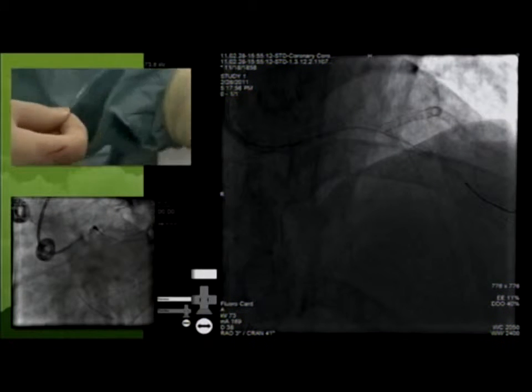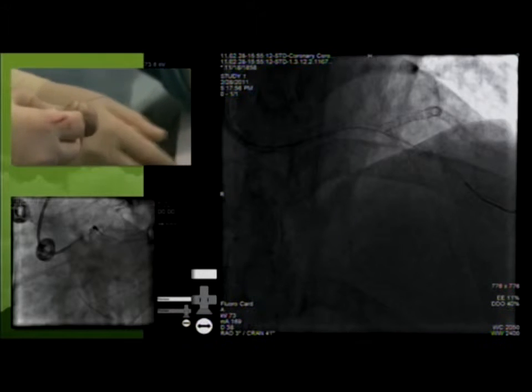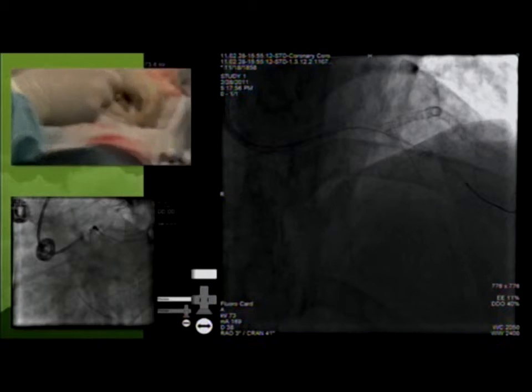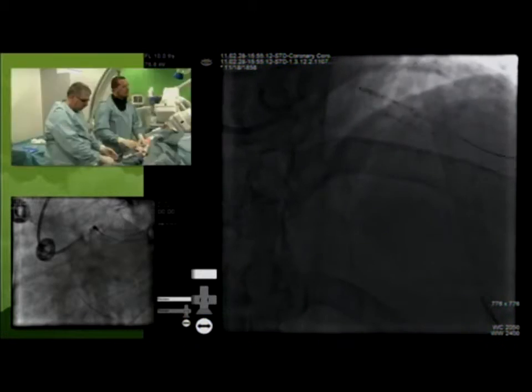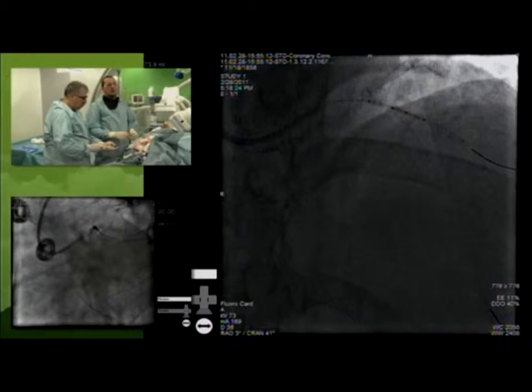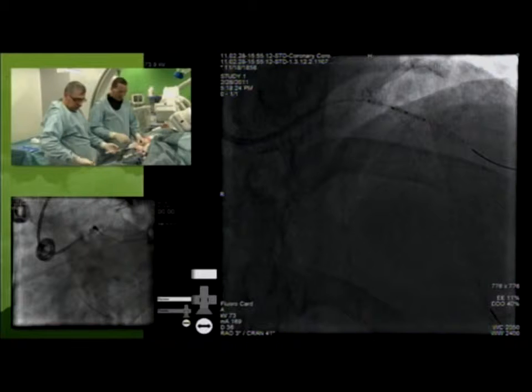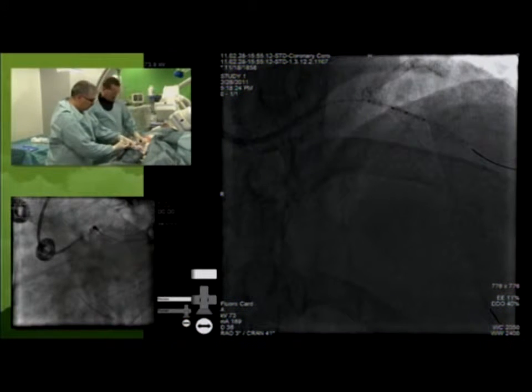And also the fact that the side branch stent is not a DES stent. With the bare metal stent, the in-stent restenosis is very, very low. Yeah, I think the effect of bare metal stent has a lot to do with how much plaque there is and how severe the lesion. I wonder in these side branches, are some of them covered? And maybe the stenosis is not so severe. In this one, it is severe. But yeah, I think that's why you need to do this in the confines of a carefully controlled, randomized trial.